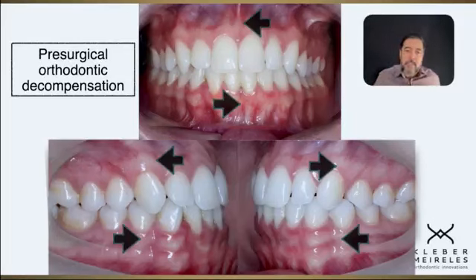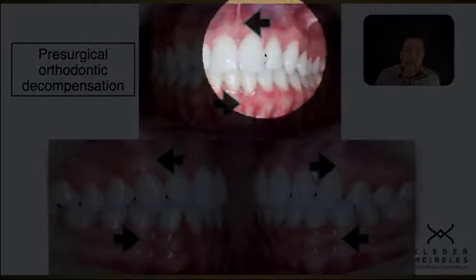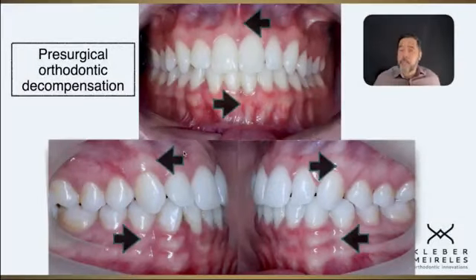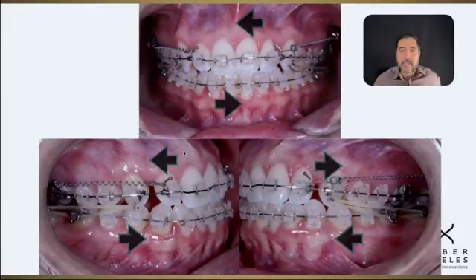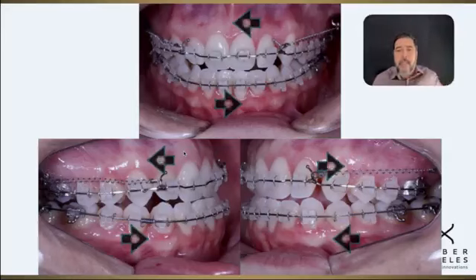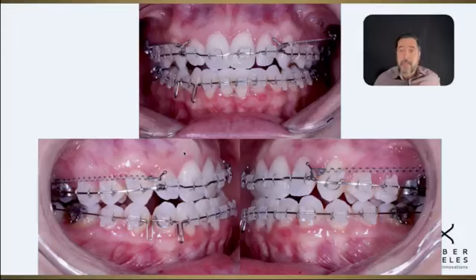The compensation that was done before was in order to compensate for the asymmetry, the lateral asymmetry, and also the anterior deficiency of maxilla and prognathism of the mandible. When we did the treatment for removing the compensatory inclinations, what we see is this. Look, going forward with anterior teeth and changing the inclination, just using standard brackets for that.